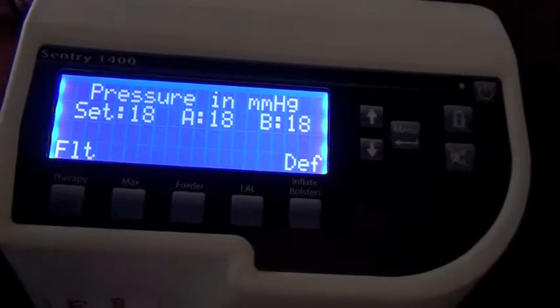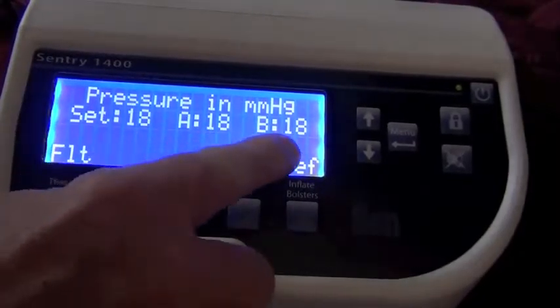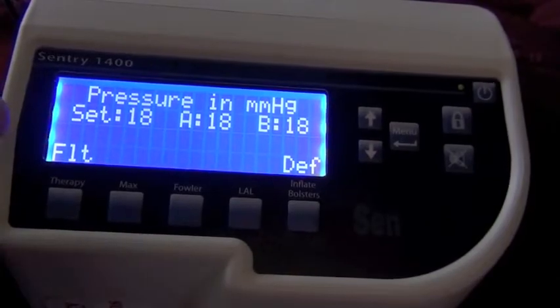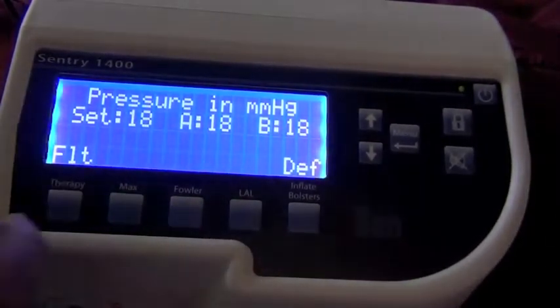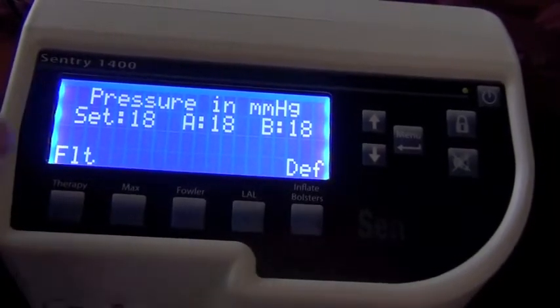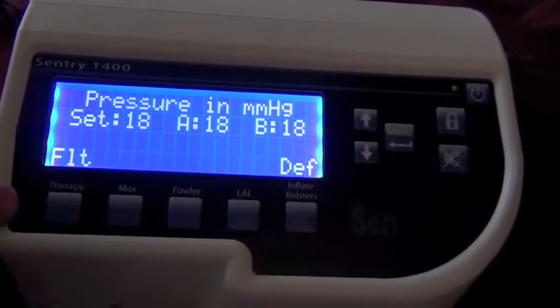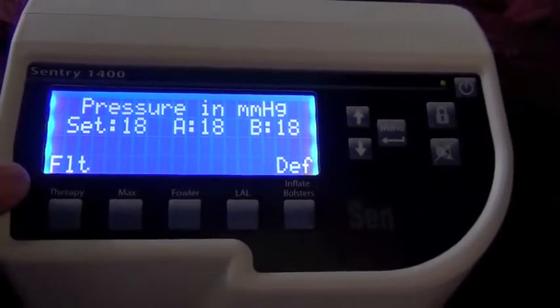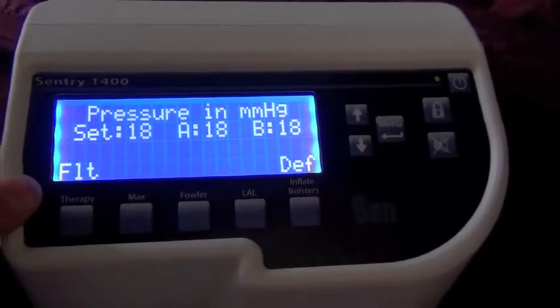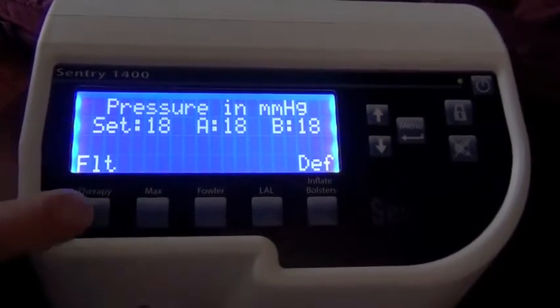There are 20 air pillows on this system that run side to side, and we're using all 20 to support the patient. In using all 20 pillows, the pressure in all the pillows is going to be the same. And this A-B division is really here for the alternating side, which I'm going to cover in just a moment. But it tells us that all our air pillows are achieving their set pressure, which is what we want. Float therapy would be used in patients who do not tolerate the AP system for whatever reason. That would be the only real indication to use it clinically.